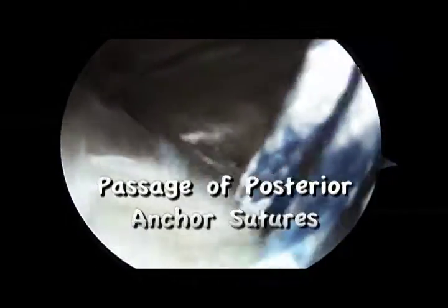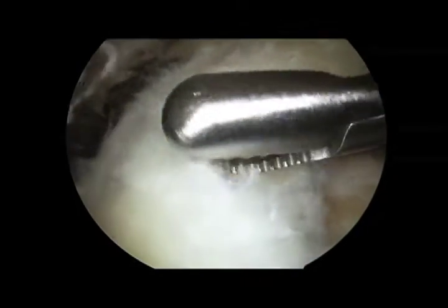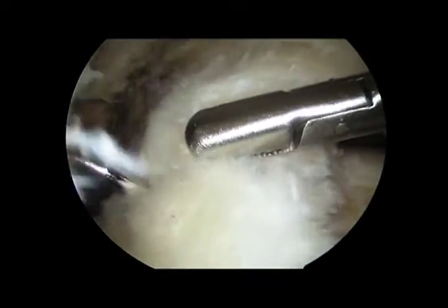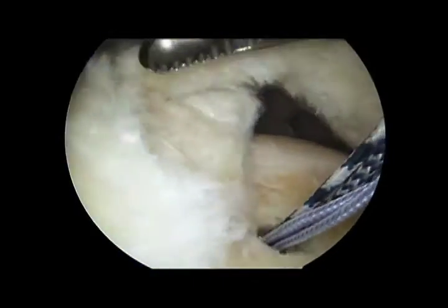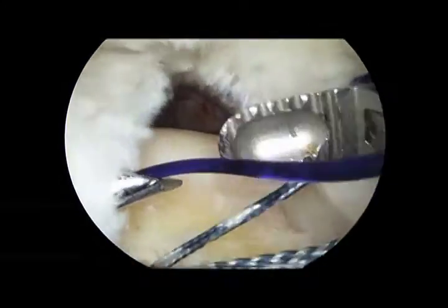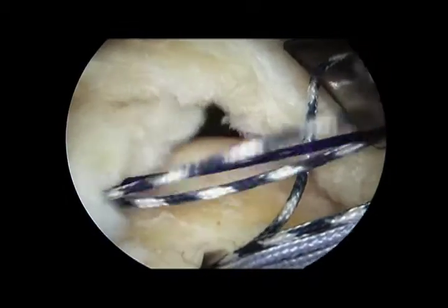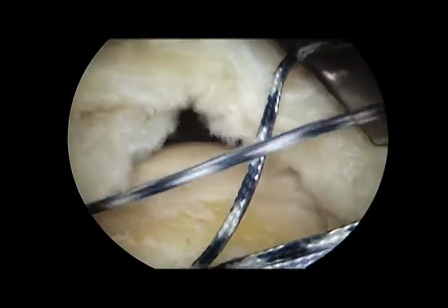The repair begins by retrieving the medial limb of the most posterior suture at the anterior cannula. Using a crescent-shaped suture shuttling device via the posterior cannula, the intact infraspinatus tendon is pierced 1 centimeter posterior to the anterior edge, and a PDS suture is passed through the device. This is retrieved using an arthroscopic grasper at the anterior cannula, where the PDS suture is used to shuttle the retrieved posterior suture limb back through the rotator cuff and out the posterior cannula.